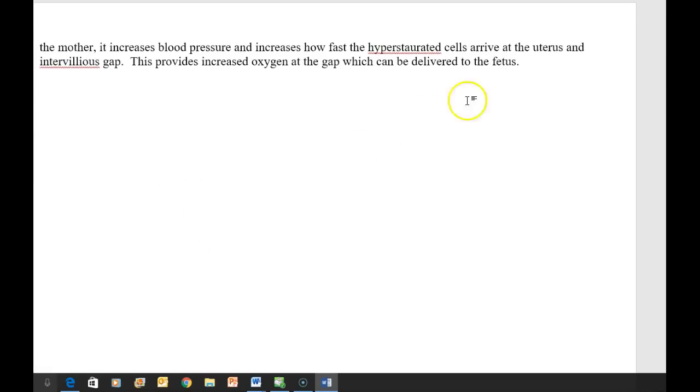There is a little mnemonic that I'm going to give you here, and it is called VEAL CHOP. Okay, so variables mean cord compression. And of course with this one, we're just going to change positions and hope that this fixes it.